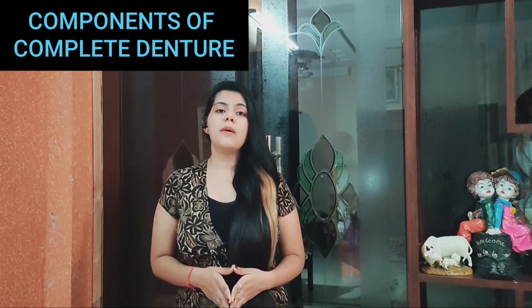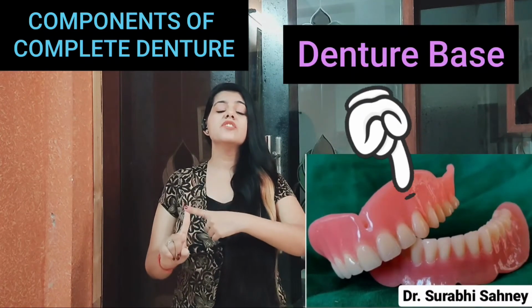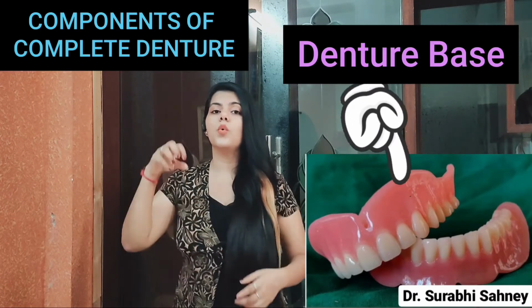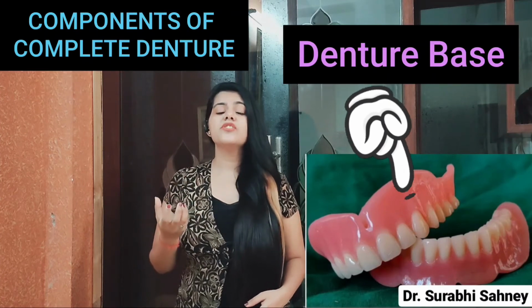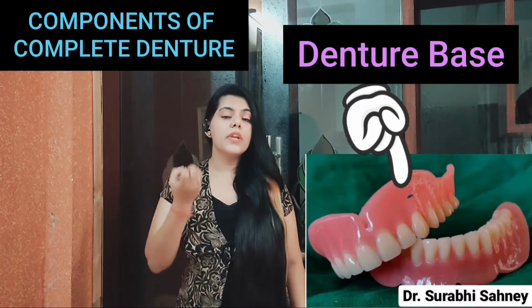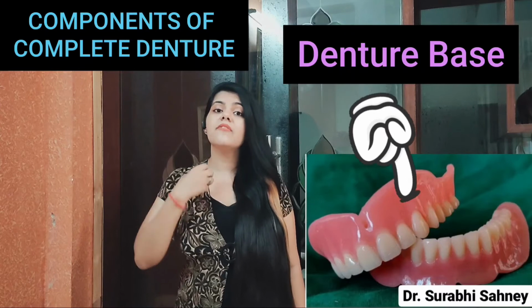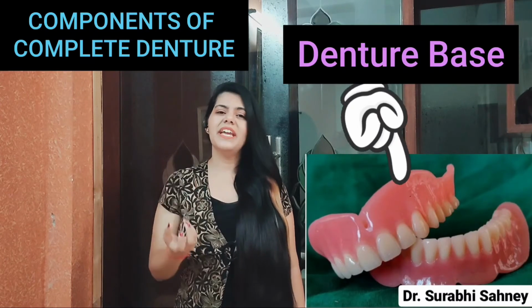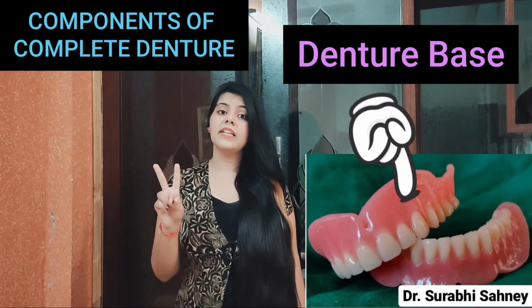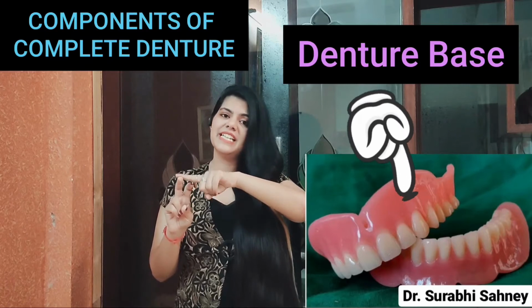Begin with the first component of a complete denture, that is denture base. It is defined as that part of the denture which will seat over the oral mucosa and to which the teeth are attached. It is the main foundation of the denture. It helps to enhance and has a direct influence on the health of the oral tissues. It is made up of 2 types, either the acrylic denture base or the metal denture base.